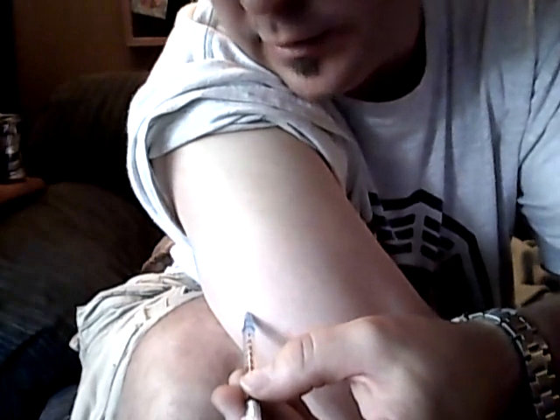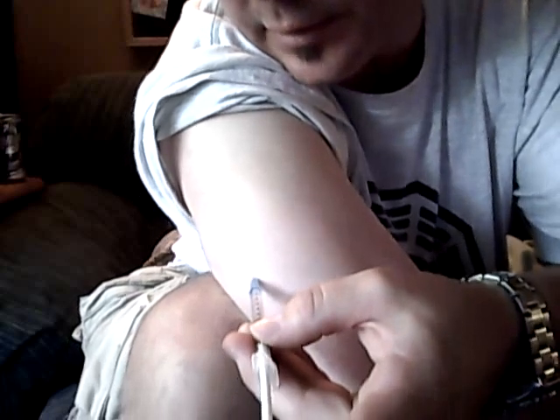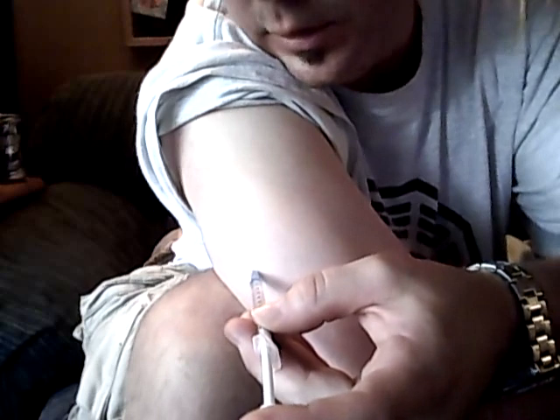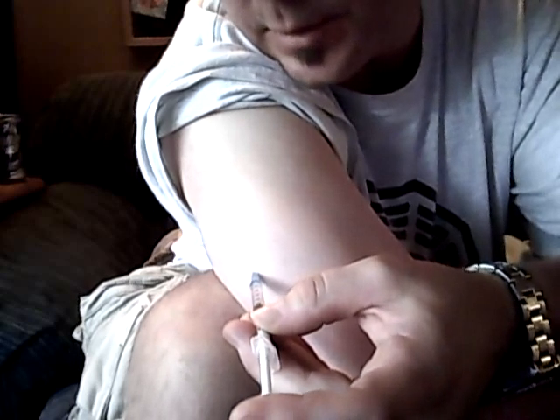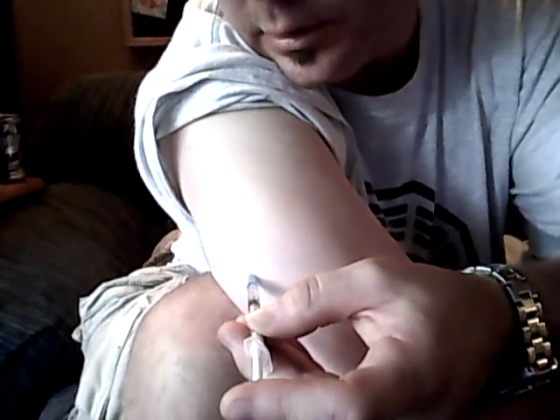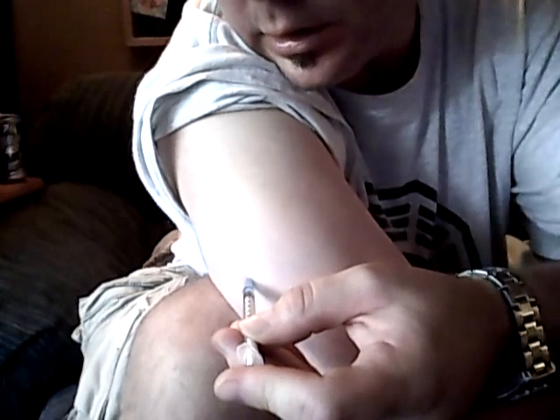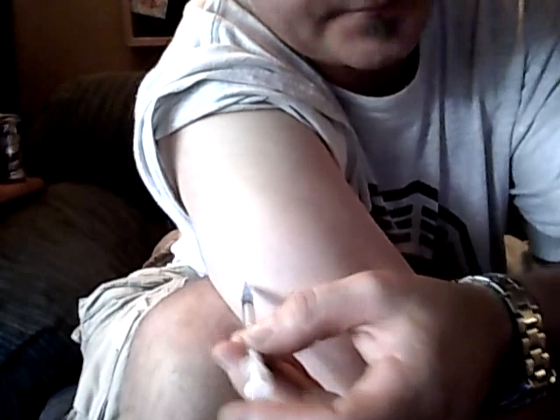And luckily I had my index finger in the right place to actually push down on the plunger. And you just give it nice and slow. You may see a bump come up underneath the skin. And we're done with that. And it's probably going to bleed a little bit. It's not bleeding so much, but I'm losing a little bit of the med, which you can't really see. There's a little drop of it there. So I'm just going to hold a little bit of pressure there.